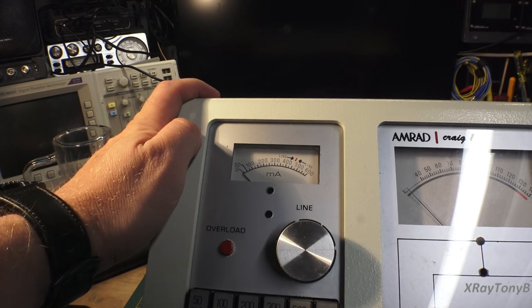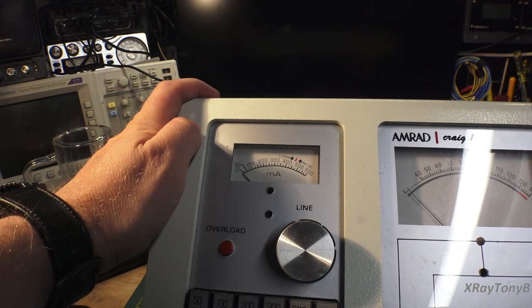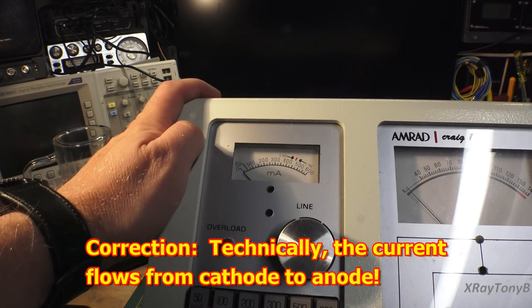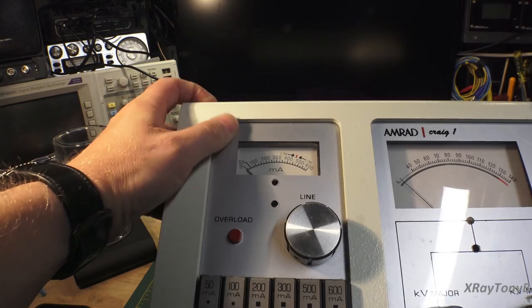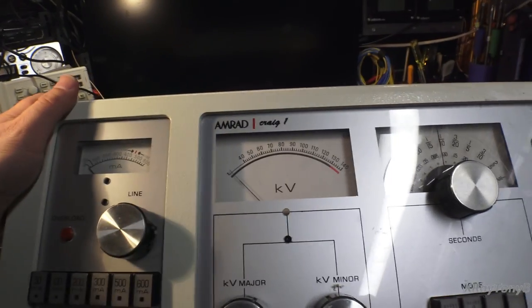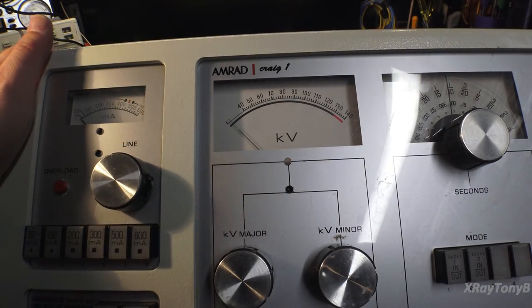MA represents the current, in milliamps, that is flowing from the anode to the cathode of the X-ray tube, and we're going to get into that later. And you can see it's adjustable. We have several different preset MA stations, as we call them, to vary the amount of current flowing through the tube. The next parameter that we adjust is called kV or kilovolts.